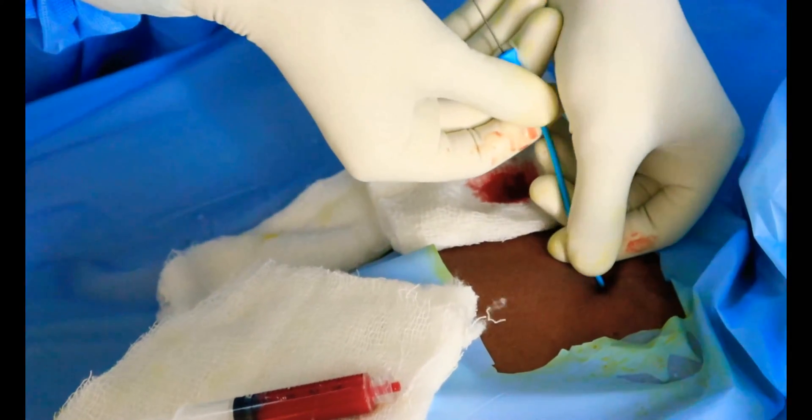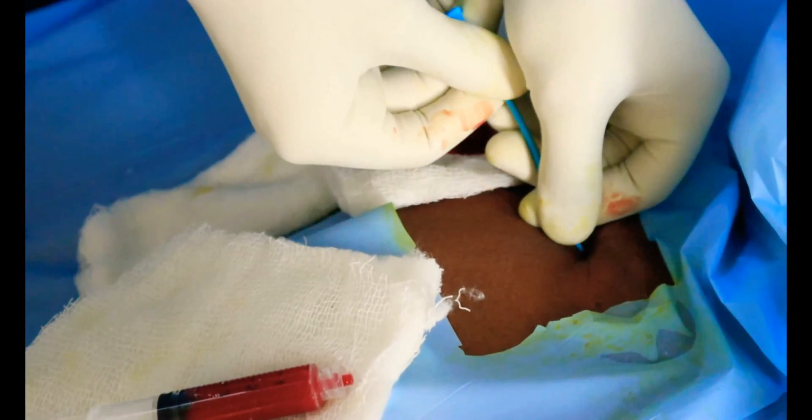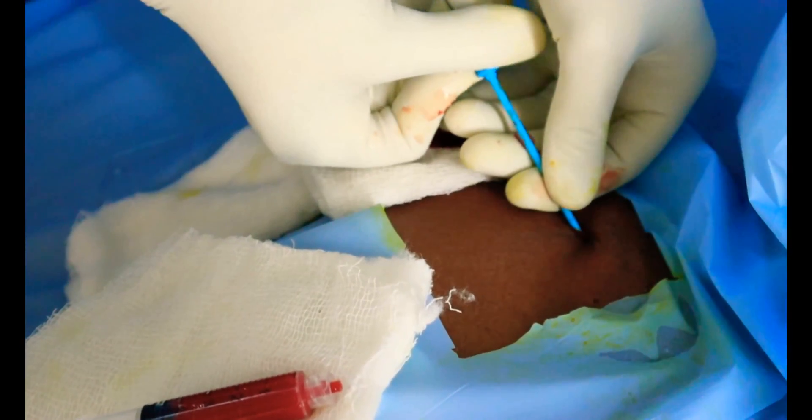Now pass the dilator over the guide wire, dilate the tract to the depth of the target vein, and remove the dilator.